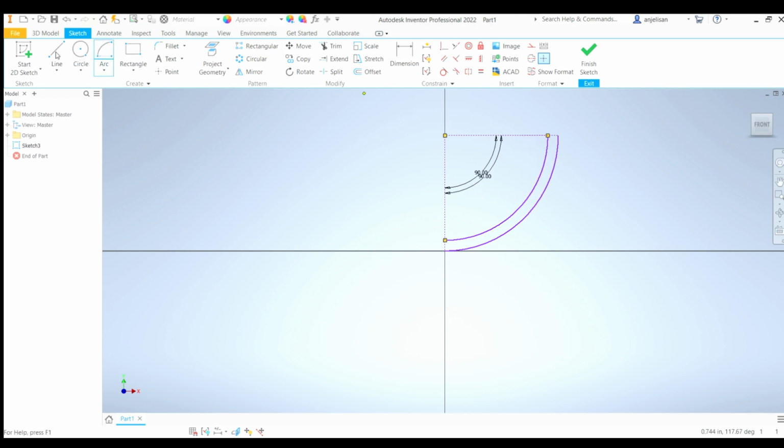So now you can see we're getting our cross-section shape where this has an actual thickness. Just go ahead and close off this shape by hitting the line tool and then clicking on one point, the end of the first arc, and then click on the second point, the second arc ending. Do the same, close off this part of the arcs, and voila. So that is half of our cross section.